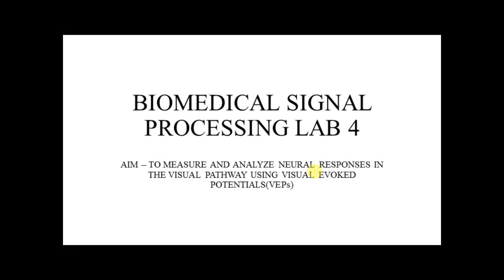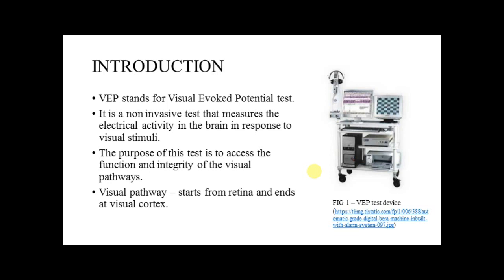So, good afternoon, guys. For today's experiment in this lab, the aim is to measure and analyze the neural responses in the visual pathway using visual evoked potential. Okay. So here, the first thing in the introduction we need to know is what is visual evoked potential.